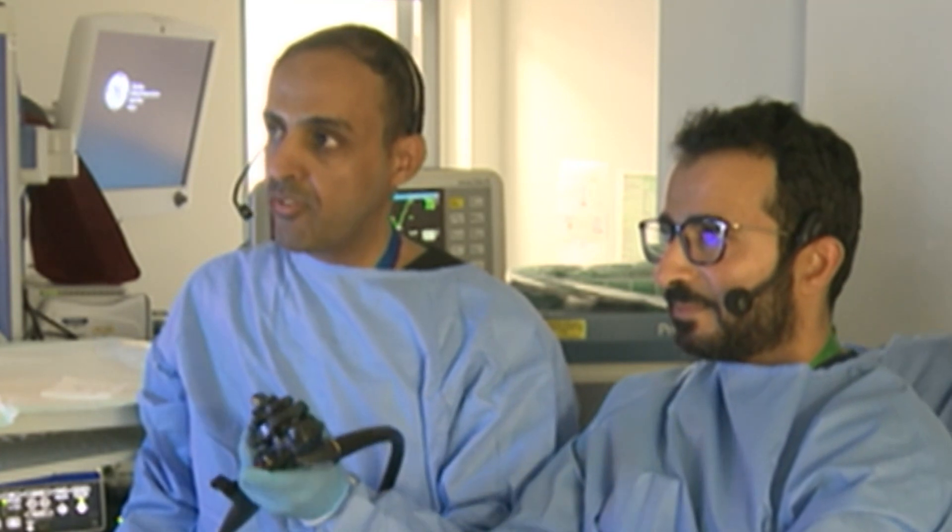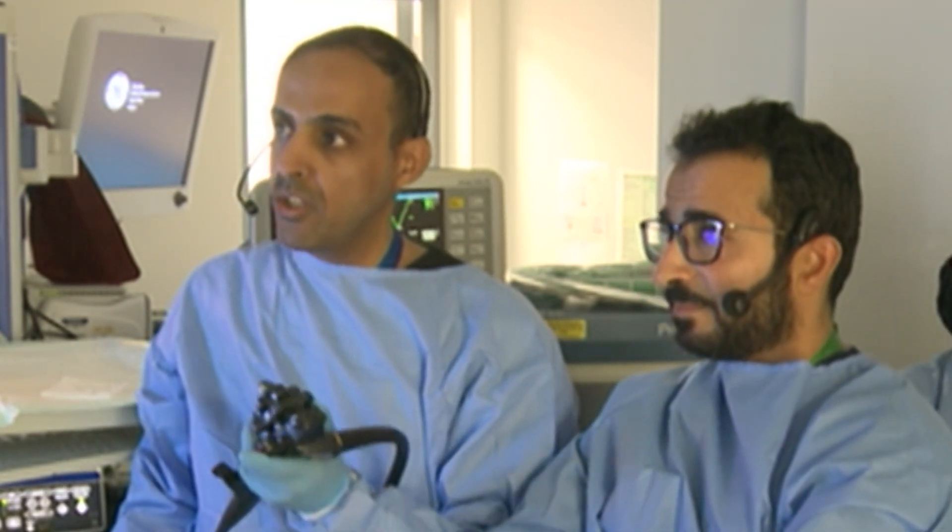We will demonstrate ultrasound-guided liver biopsy in this patient. We are seeing the liver here — the left hepatic vein, segment two, and segment three.